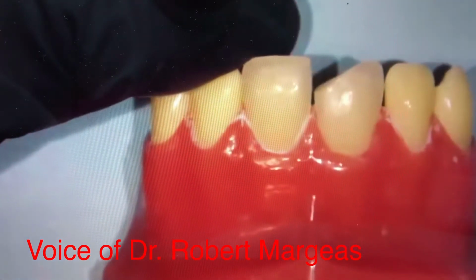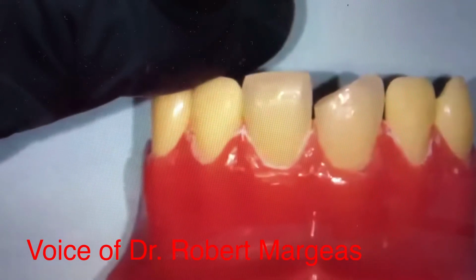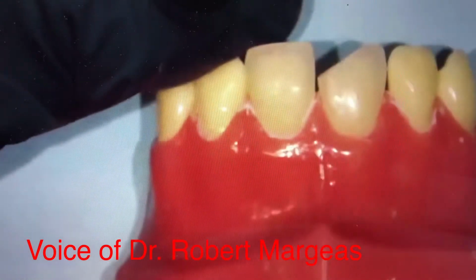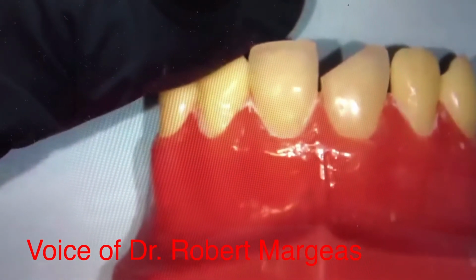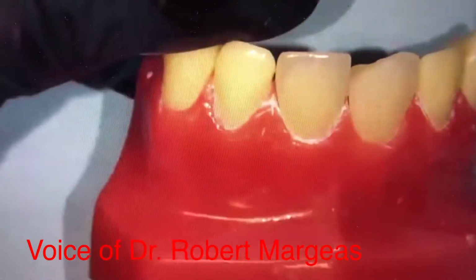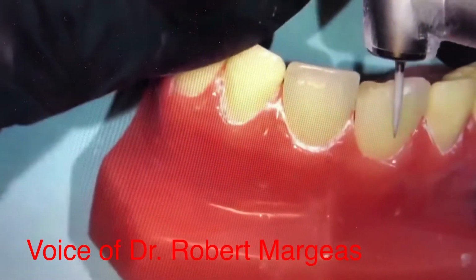If I don't take enough away, I can't block the fracture line. I would say that's what I see the most with the failures of a class 4, is that it wasn't beveled deep enough and we weren't able to hide that margin. So what I'm going to do here is I'm going to bevel this.